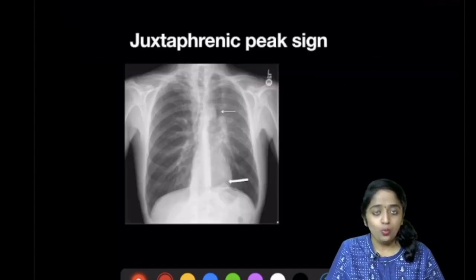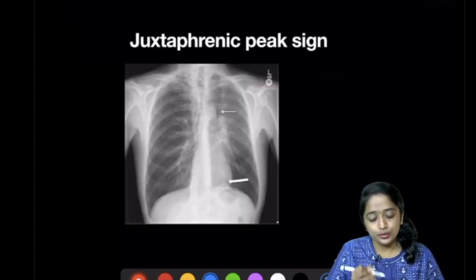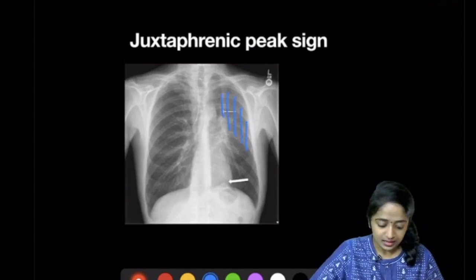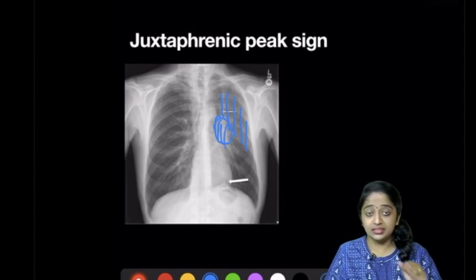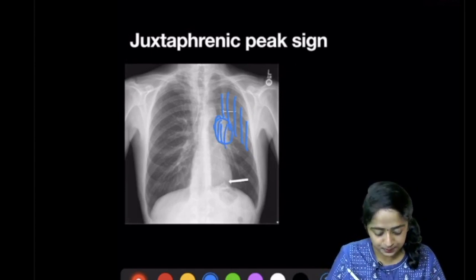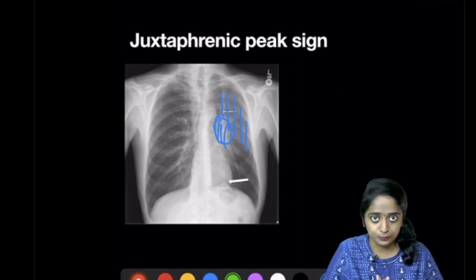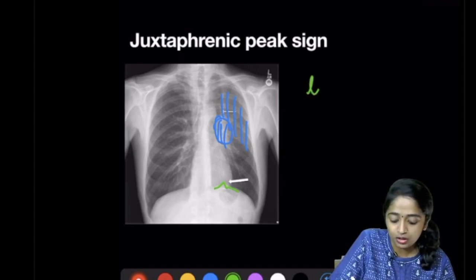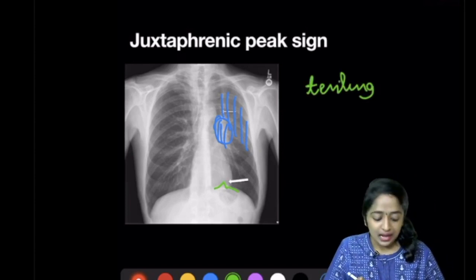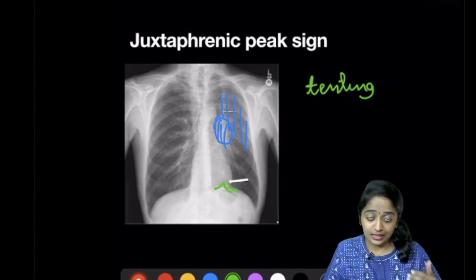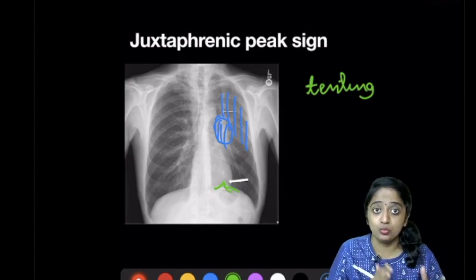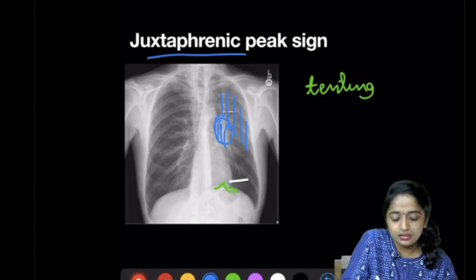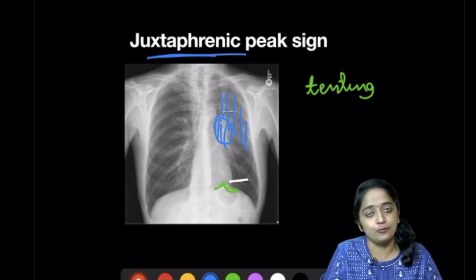Coming to the last sign — the juxtaphrenic peak sign. In this picture, there is a veil-like opacity with added density at the hilum — this is a case of left upper lobe collapse. If you scan all lung fields and structures carefully, you can see a peaking or tenting of the diaphragm. This tenting of the diaphragm is seen as an additional finding in cases of collapse on either side, and is called the juxtaphrenic peak sign.